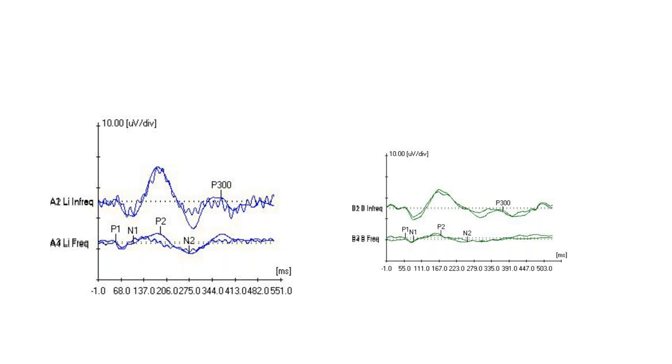There's a comment, ma'am, to this question that was asked earlier. In CI, it's the RF artifact. Nothing much can be done. Good for bringing up this point. When you're doing electrical cortical potentials or auditory brainstem response, there is RF artifact, and instruments do have an RF filter for that. For example, when I use Biologic, I have an RF filter with it, which can be used to reduce these artifacts. I've used it with ABR, so I'm sure it should also help with cortical evoked potentials.